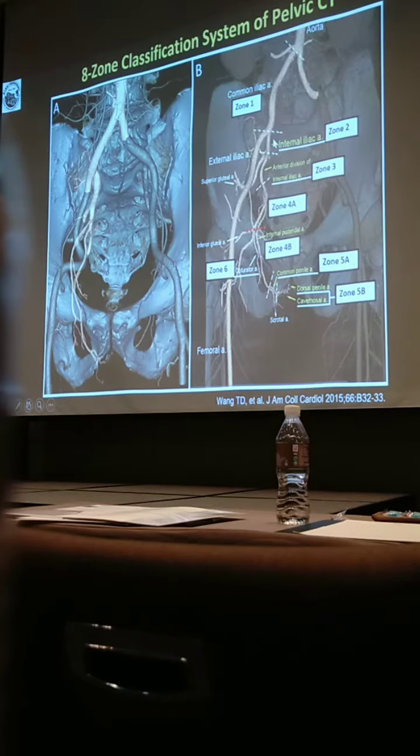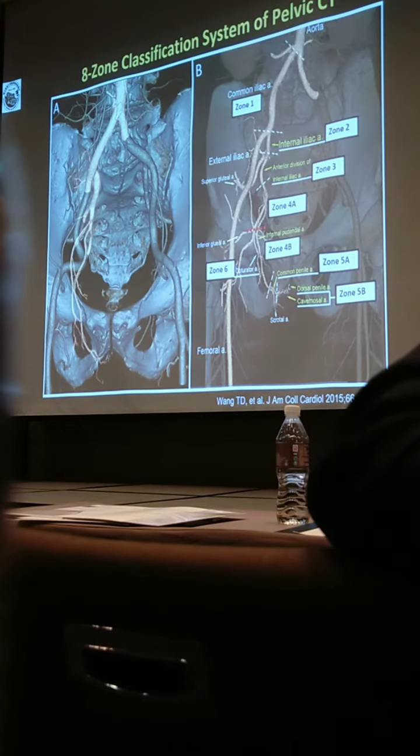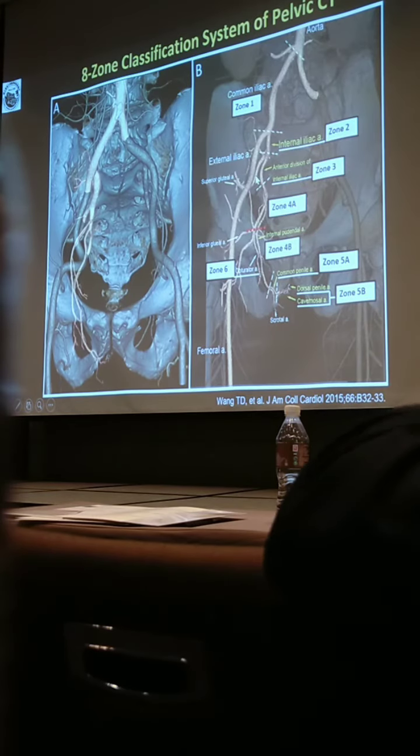And then there's an anterior division. It's better to realize it on the lateral projection, but I will introduce that in the next slide. You just look here, that's the anterior division. And the other, that's the superior gluteal artery. It will supply the upper part of the buttock. So if the patient has a lesion here, the patient will feel claudication. It's called buttock claudication.